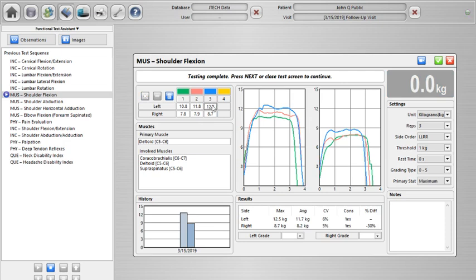And the software will quantify, again, the max values. We can actually see the peak for each one of these. Repetition 1 in green, repetition 2 in red, repetition 3 in blue. And we can see down at the bottom the calculated results, including things like percentage differences of the maxes on either side. So we actually have a fairly significant right side deficit of about 30%. If we wanted to see this in pounds rather than kilograms, we can set it to pounds, for example. All of the conversions happen in real time, so you can simply toggle those and the software will keep track of them.